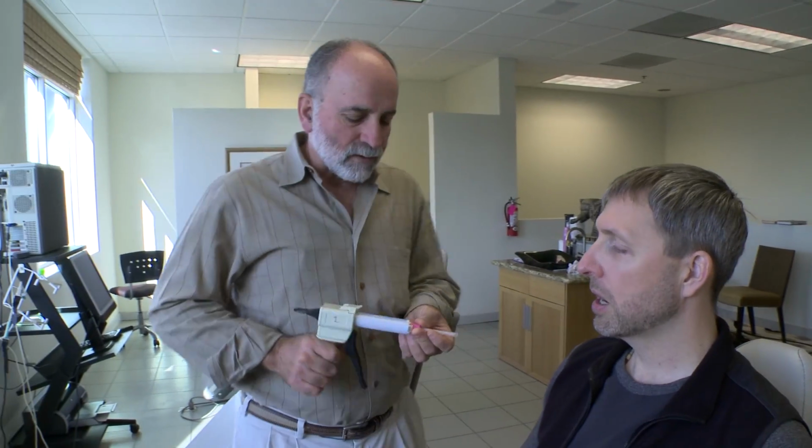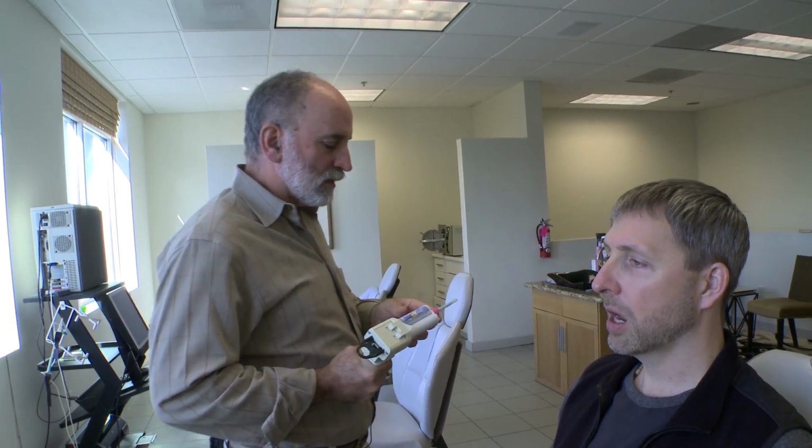Another squirt. This is how we typically do this. We go through a large number of little squirt tips.